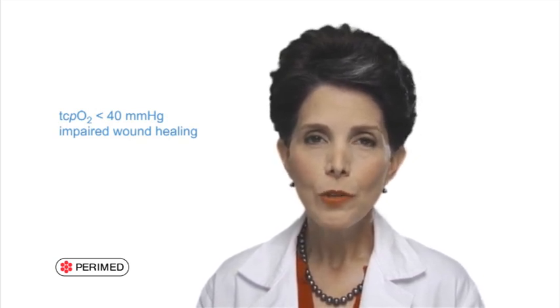Values in healthy people are usually a bit lower on the foot than they are on the leg. 38 studies since 1982 suggest that hypoxia sufficient to impair or prevent wound healing is defined as a tcpO2 less than 40 millimeters of mercury. So tcpO2 values obtained while breathing normobaric air can be used to predict which wounds will not heal spontaneously.